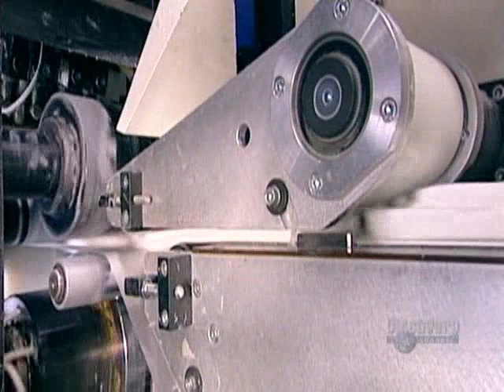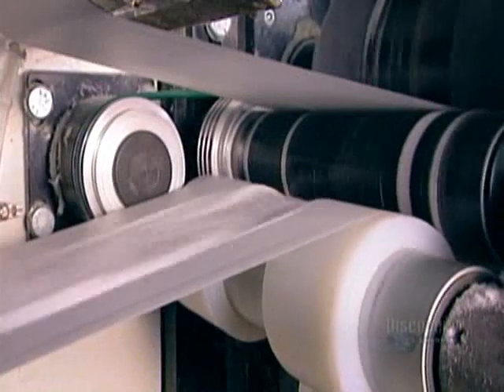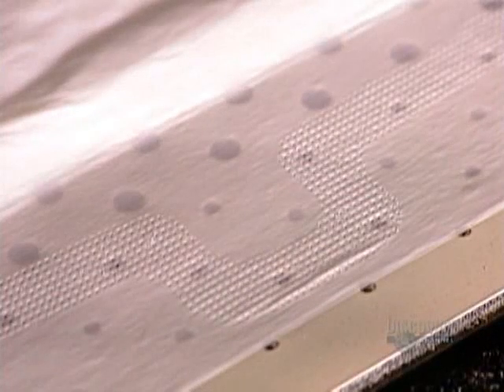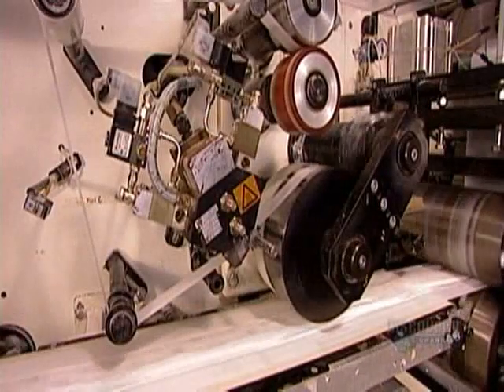Now the machine sandwiches the layers between plastic sheets. The top one is perforated to allow fluid to pass to the absorbent layers underneath. The bottom one acts as a leak-proof barrier. A roller stamps the contour of the pad, sealing the absorbent layers inside.